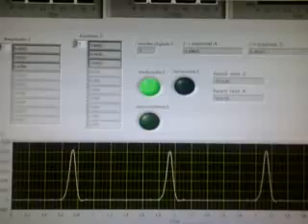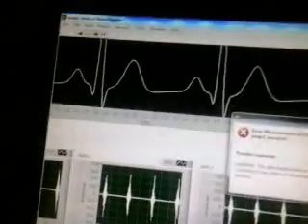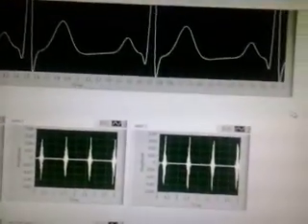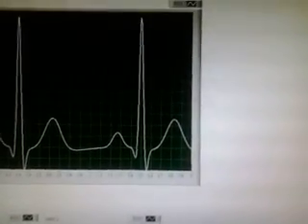And now coming to the part of UDP. This is the remote host. This is the local port, remote port, and the reception. That is the number of signals that the UDP have to take at each iteration. The data in the form of a string.